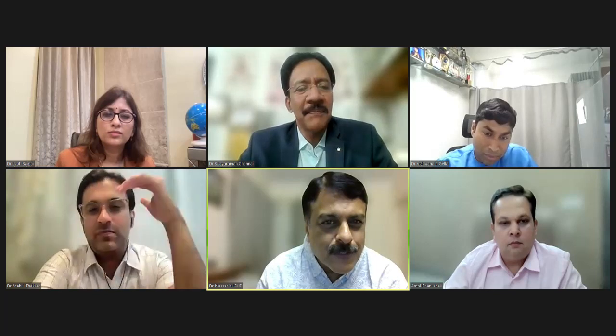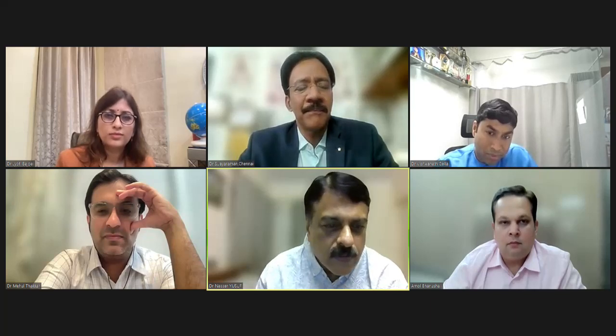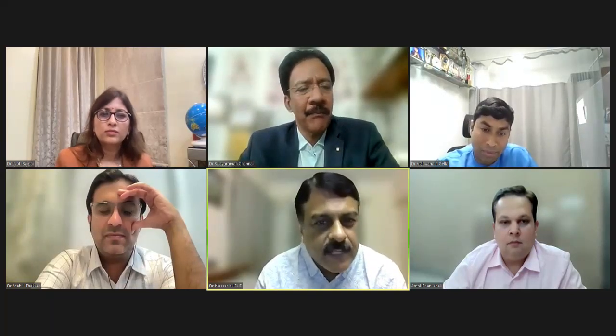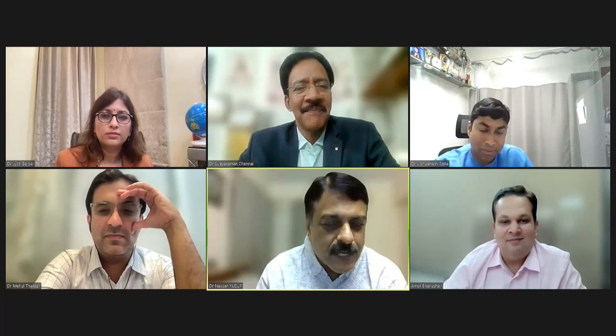No, I quite agree with Dr. Jayaraman's view, and ultimately the decision is by the patient, what he wants to do. But an interventional pulmonologist, a good thoracoscopist, can deal with stage 1. Coming to that nice question which Dr. Jayaraman raised about suction cautery, that's quite effective. It's a single instrument which will suck and at the same time cauterize. Now, the problem is when there's a bleed, blood is pooled there, so the cautery does not work. So you need a dry field, and a dry field means you need to suck it out and then cauterize it. But this instrument, what he said, suction cautery, is quite effective. I have to support that statement of his. And in fact, I showed it in my video. Yes, sir. You showed it. Suction cautery. Thank you.